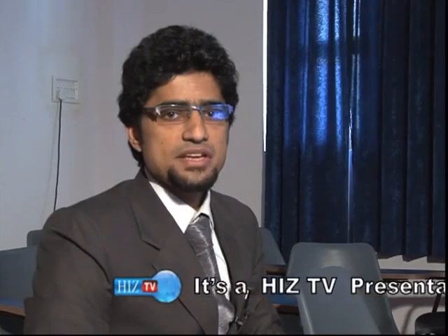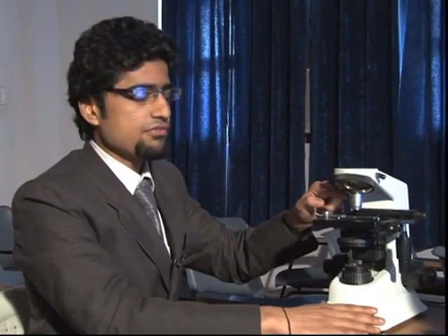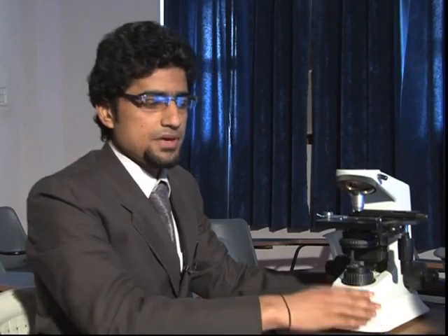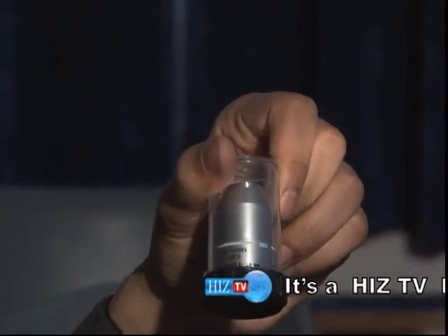For the installation of the microscope, we need to understand each component. Starting with the trinocular microscope, this is the major component with an attached 4x lens zoom. The other three lenses are provided by the company: the 10x lens zoom, the 40x lens zoom, and the 100x lens zoom.